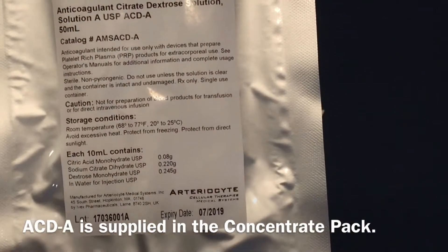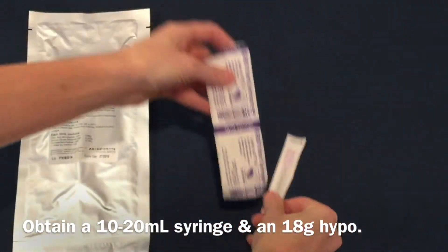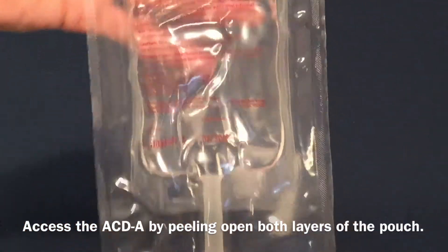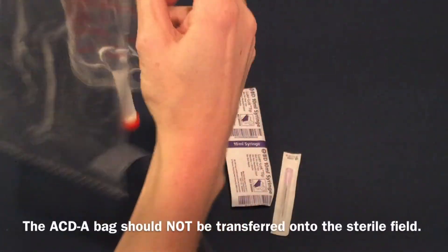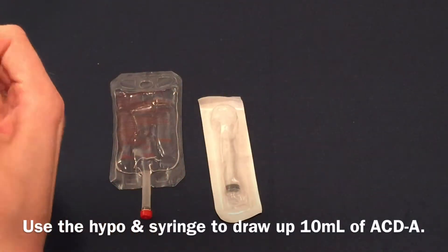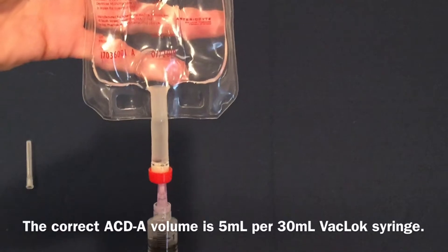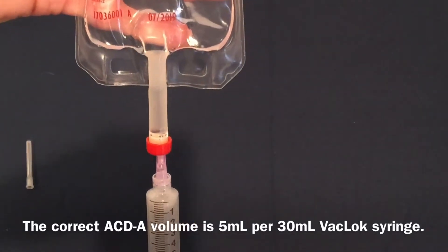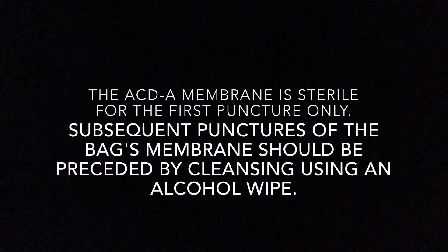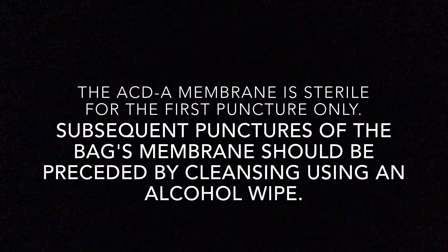ACDA is supplied in the concentrate pack. Obtain a 10-20 mL syringe and an 18-gauge hypo. Access the ACDA by peeling open both layers of the pouch. The ACDA bag should not be transferred onto the sterile field. Use the hypo and syringe to draw up 10 mL of ACDA. The correct ACDA volume is 5 mL per 30 mL VacLok syringe. Reserve the extra ACDA for subsequent cycles for the same patient or point of care. The ACDA membrane is sterile for the first puncture only.